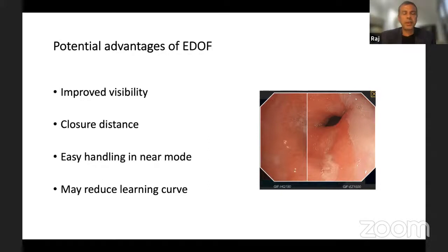Yeah, certainly. I suppose that is one of its applicabilities and advantages. But again, in all of this, technology is one thing, but technique is still important, and we should not forget that. With all of the ability to focus on an area, we also have to be mindful that one needs to understand what they're looking at.